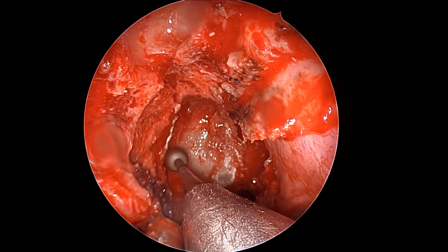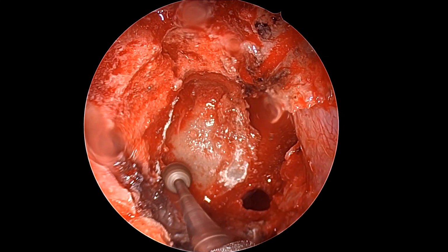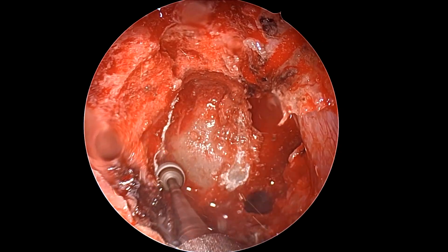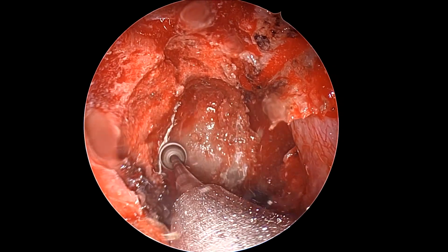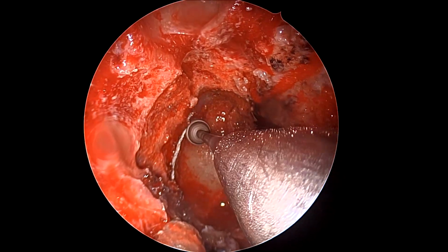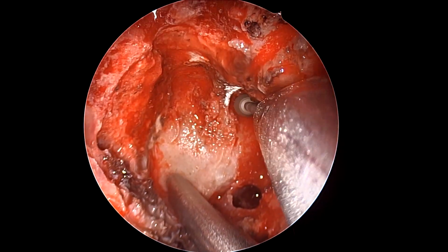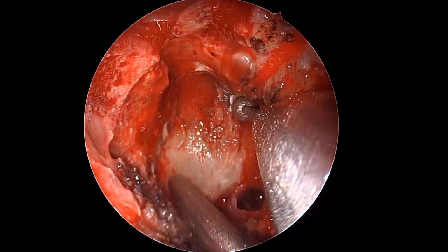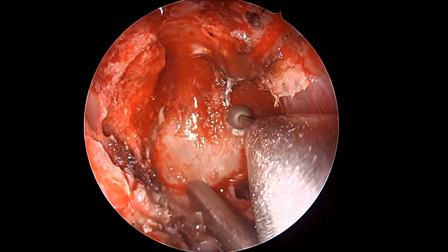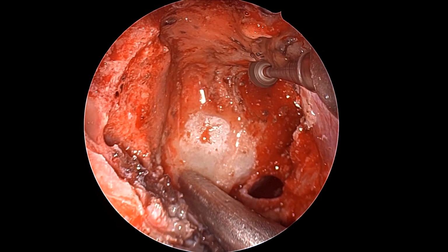And as well as laterally, though we are not going transpterygoid here, we are using every bit of the ethmoidectomy space that we have created to drill laterally towards the orbit to get maximum space for not just drilling, tumor manipulation, as well as being prepared for any contingency in case there is any vessel rupture due to any inadvertent injury. The first thing you want is space, and to prevent or even put a muscle patch or something like that, because if there's no space and you operate in a blind, small hole, that is a recipe for disaster. You want to make all margins flush.